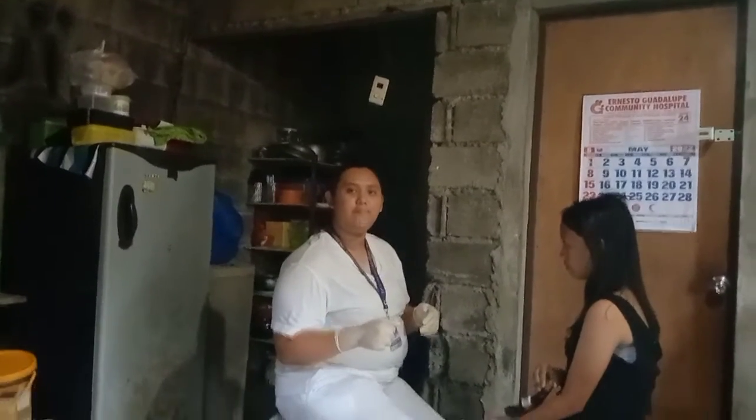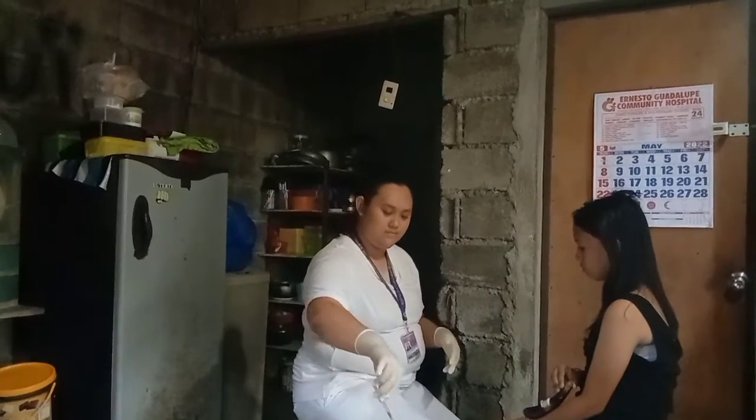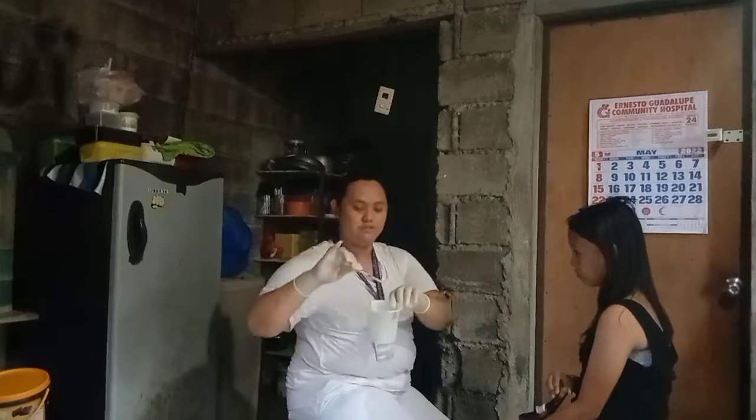Okay. Don't recap used needles. Discard needle and syringe into an appropriate receptacle. Wash hands, document the procedure, and interpret the results after 30 minutes. Used needles need to be placed in sharps disposal containers without recapping. Also, we need to dispose of them properly to avoid injuring people and spreading infections that cause serious health conditions. So I'm going to discard it.